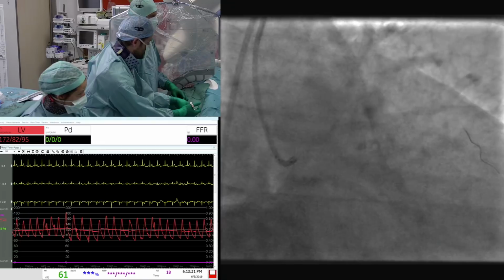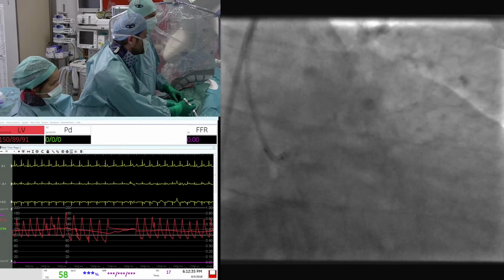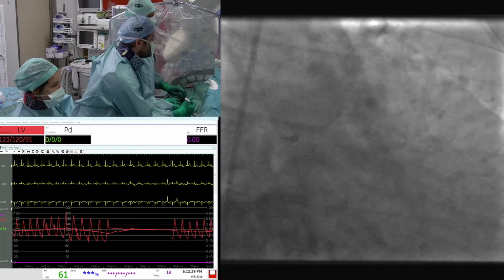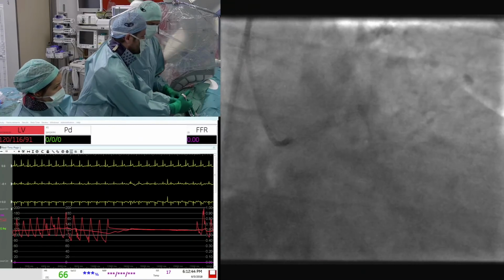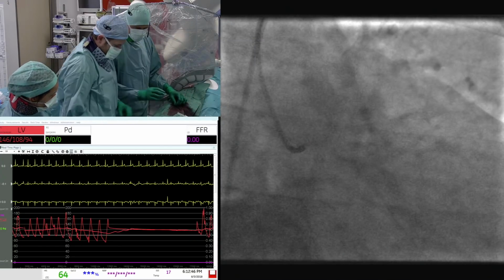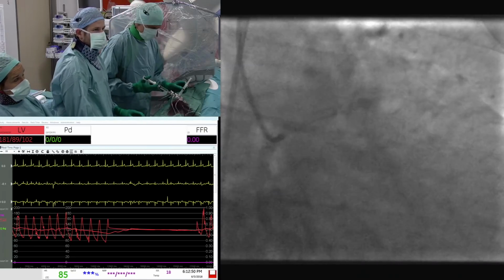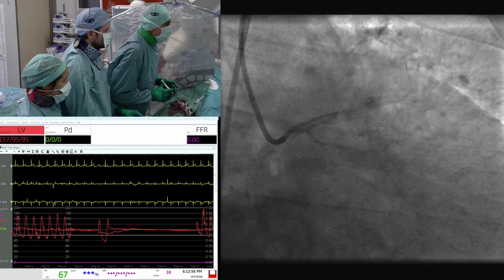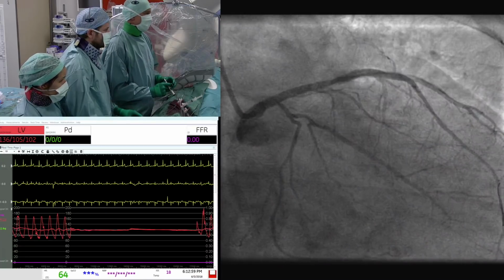important, because now theoretically we could engage the stent. I'm not going to push because probably there are struts which are in the aorta, so we can destroy them. Could you give it a good, yeah, we are very well engaged now. Okay, Katja, let's take 2-3 good shots. How much contrast did we use? 260.